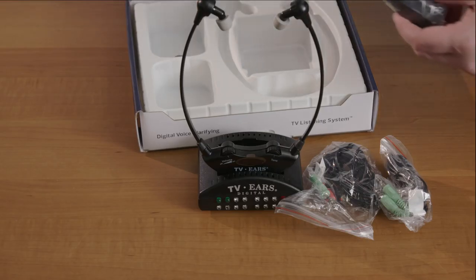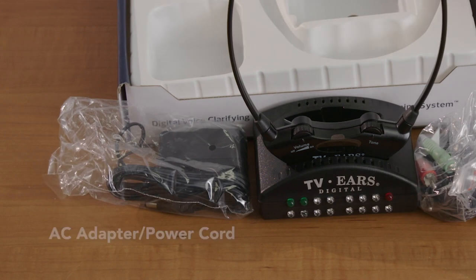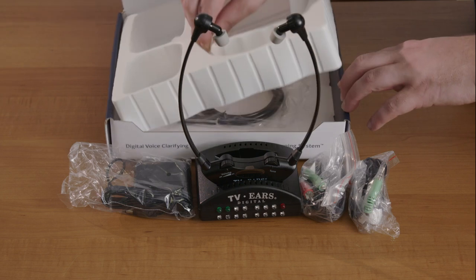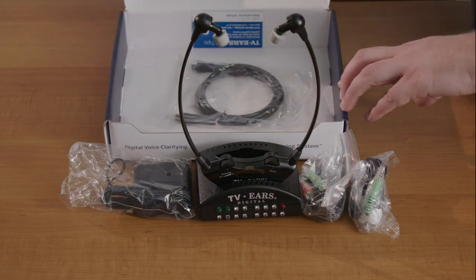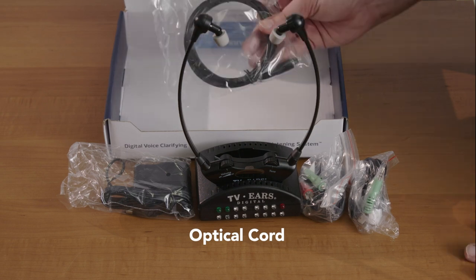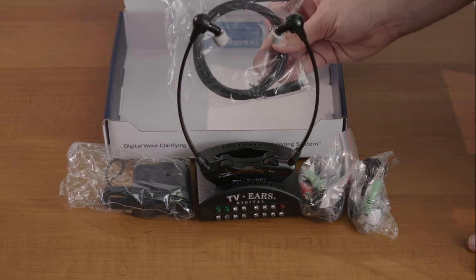Finally we have the AC adapter, a power cord for the system that will plug into electricity to provide the transmitter with power. There is also a final cord that you want to make sure you don't miss — it's underneath everything else in the box. This is our optical cord, the cord we'd use on most newer televisions, so it's probably the cord you're going to end up using to connect to your TV.